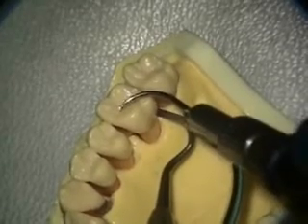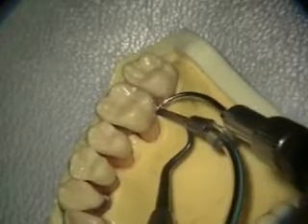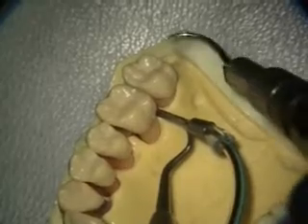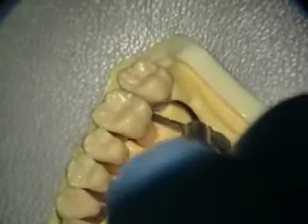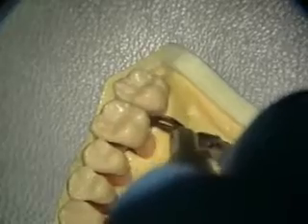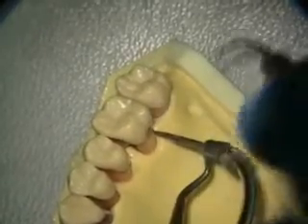These curved ones are basically the right and left versions, but we curve the distal end a little bit more like a furcation probe, and it allows us to instrument these concavities or areas where you just can't access the root with the straight one.